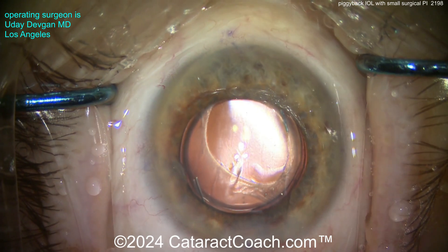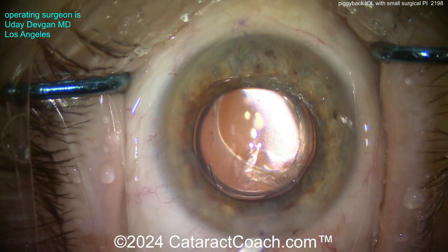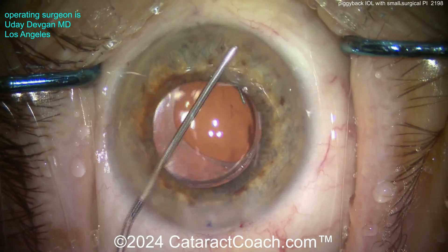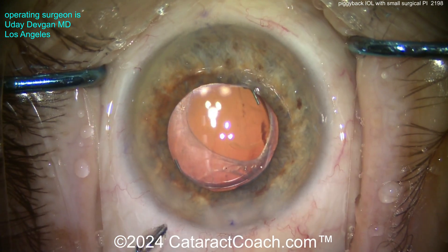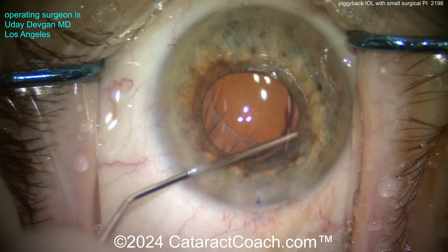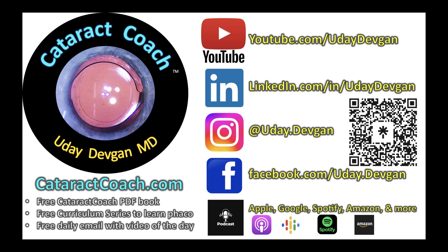Remember the magic number: 1.5 times the refraction at the spectacle plane equals the piggyback IOL power. This is a three-piece silicone lens with angulated haptics, so the optic sits a little further back than the haptics — keeping it nicely positioned and ensuring no scraping of the optic against the back of the eye. This patient did beautifully. If you ever need a piggyback lens, now you know. Check out the podcast every week — available on Apple, Amazon, Google, Spotify, and more.